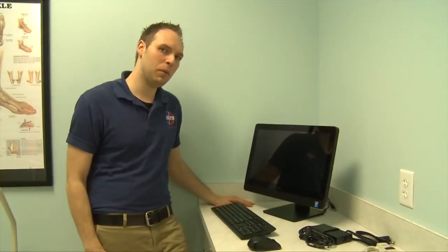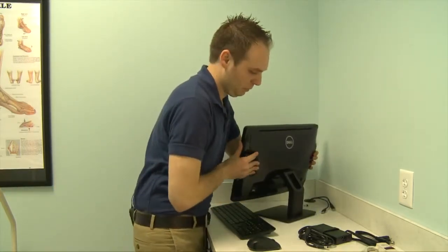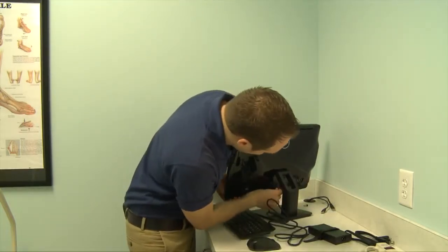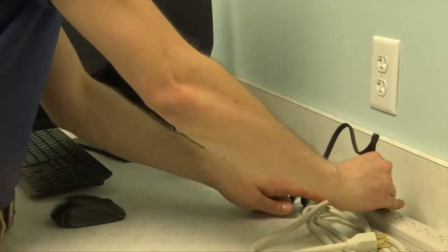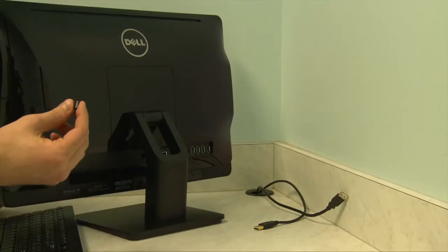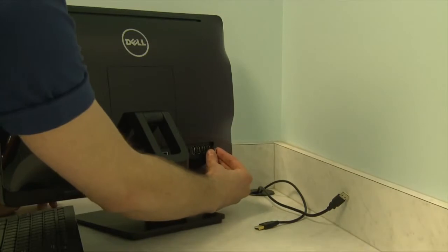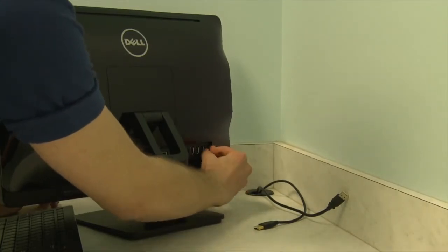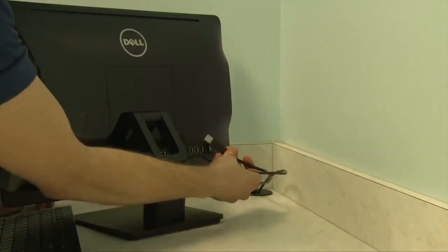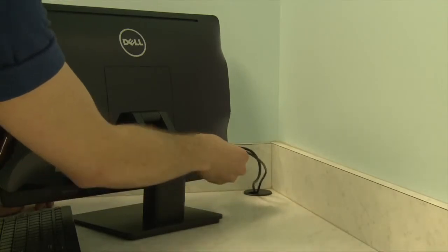Now that we have our acquired computer unboxed and in place, we're going to want to go ahead and plug in the power source. If you're going to be using the wireless keyboard and mouse, go ahead and plug in the wireless dongle into the back of the computer. Now that you have your cables ran from the x-ray system, go ahead and plug in the panel cable as well as the generator cable, also into the back of the computer.